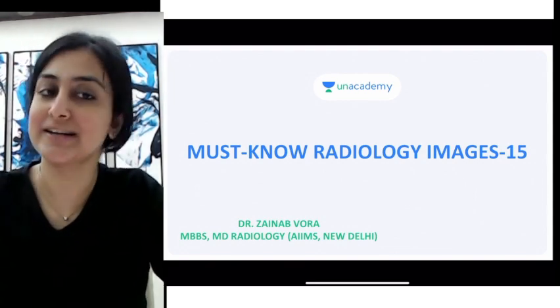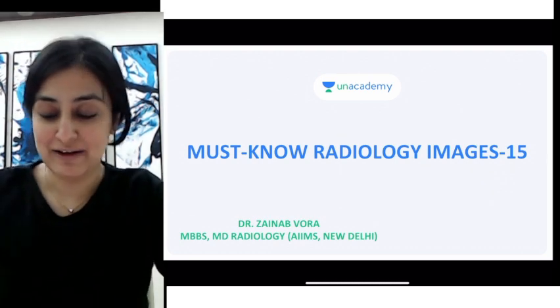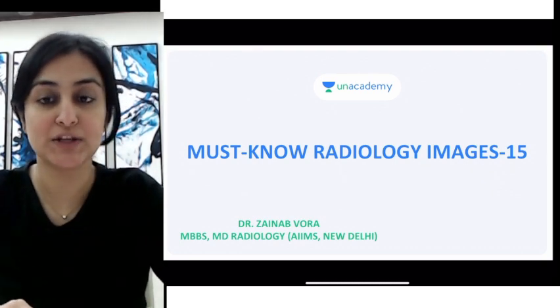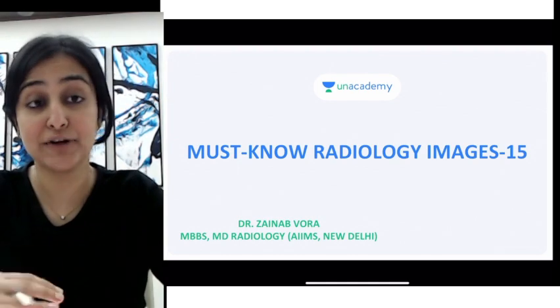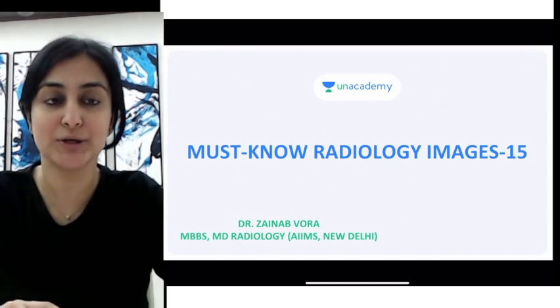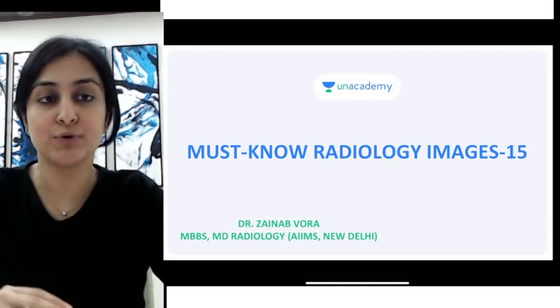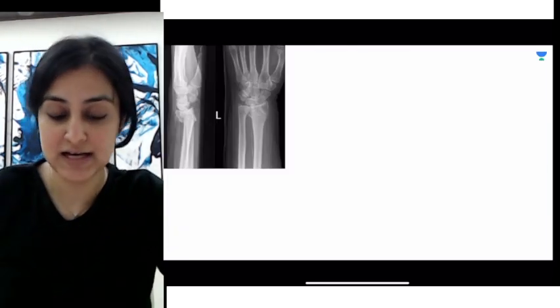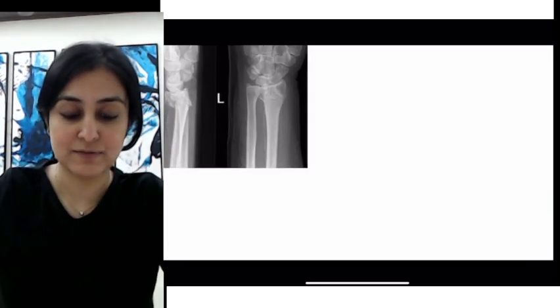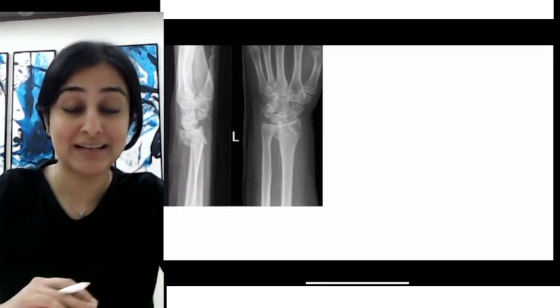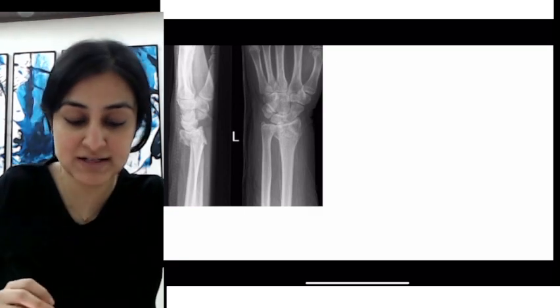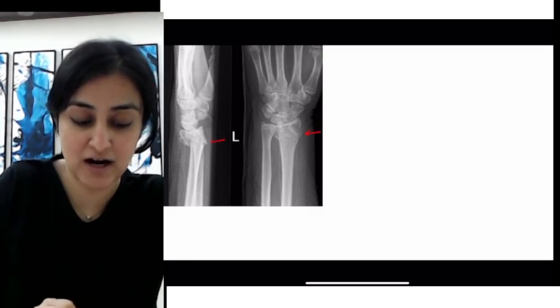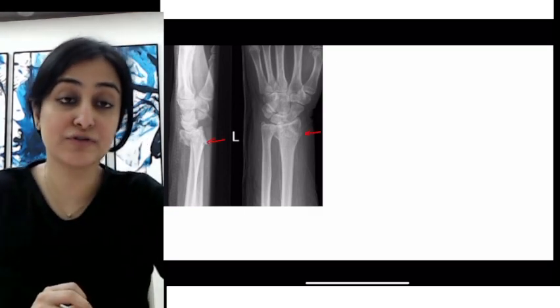The topic of today's discussion is going to be distal end of radius fractures. We want to look at 4 kinds of fractures which affect the distal end of radius. The first set of images I'm showing you is the AP and lateral view of the wrist, and what you find here is that there is an extra-articular fracture of the distal end of radius.